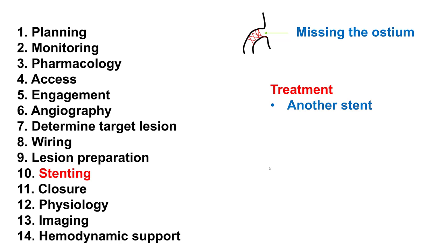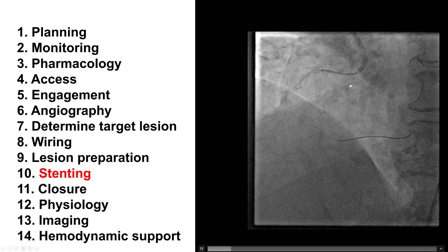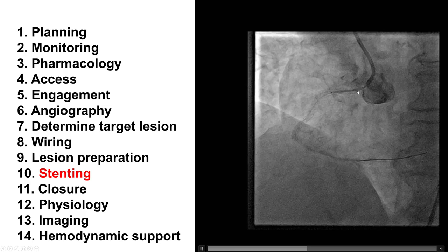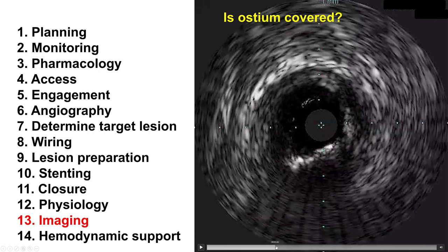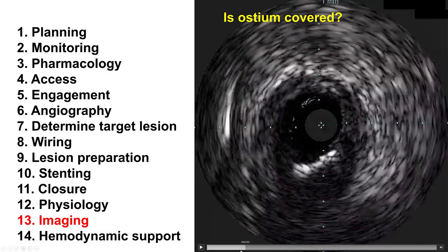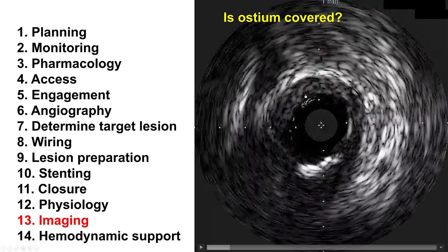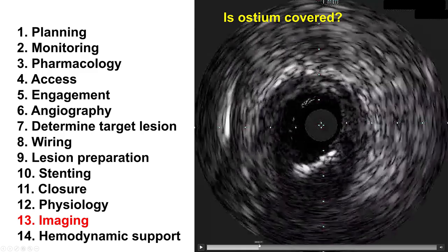This is an example of a case in which the stent is placed into the osteal RCA lesion. You can see the guide being disengaged and there is injection — the stent appears to be going all the way into the aorta. But then, once IVUS is done — and IVUS is extremely useful for confirming both that the stent is well expanded and that it covers the ostium — we can see on IVUS that there is the stent, but as we move toward the ostium, this part of the vessel does not have a stent. So the stent actually missed the ostium. IVUS is the best way to determine that.